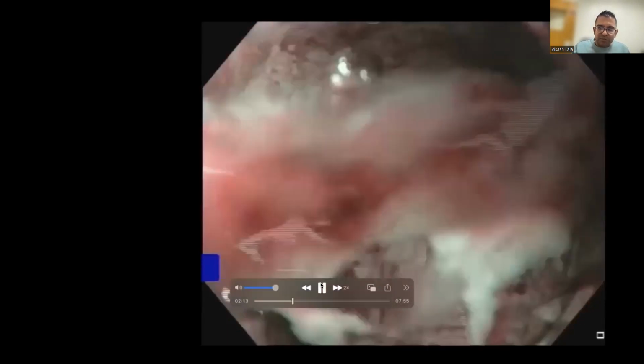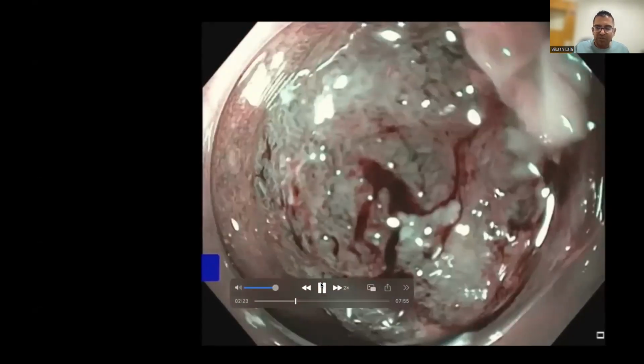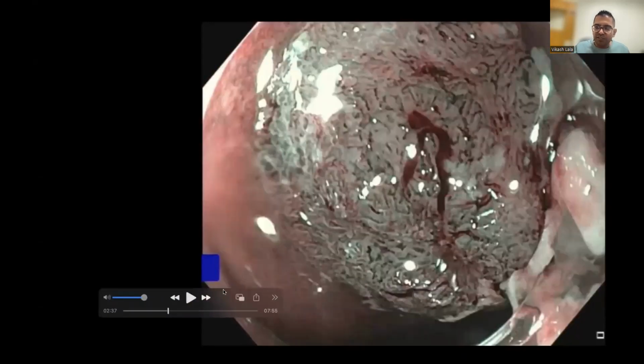So a lot of overlying fibrin on this lesion, a bit of mucus. And yes, once you traumatize a lesion and it starts bleeding, it is difficult to assess it in NBI because remember, NBI enhances everything that's red and the fluid in the blood tends to be very annoying. So there you beautifully see it, okay?